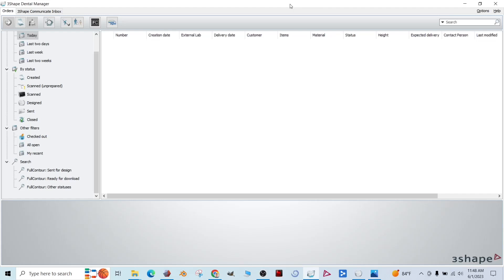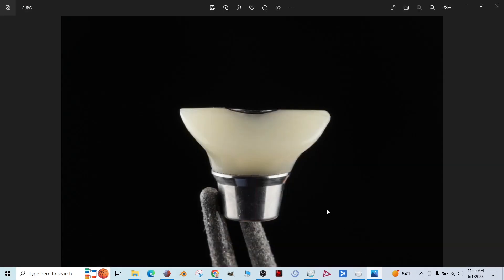Hey, good morning. I'm going to show you how to use 3Shape to design a custom healing abutment based off of a virtual implant plan so that it's ready for placement the day of the implant placement. So this is what we're looking to make. This is a 3D printed custom healing abutment on top of a non-engaging tie base.